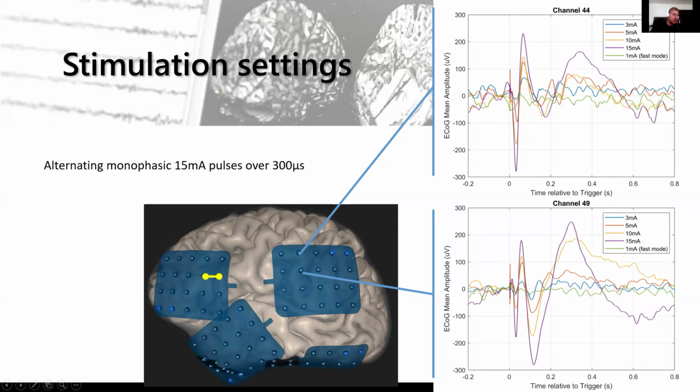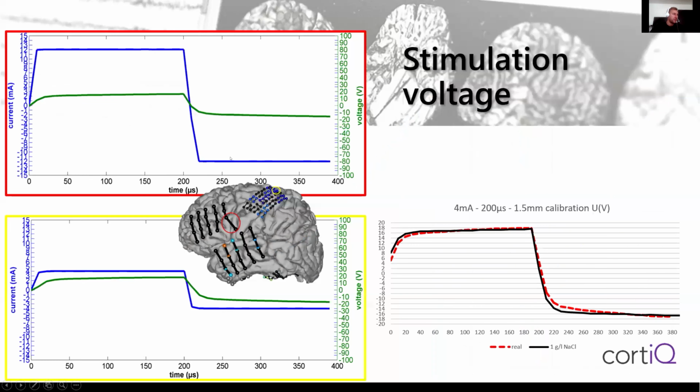Also, we can see a similar graduation in the neighboring channel. So we can see that the evoked responses grow with the stimulation intensity in the target area.